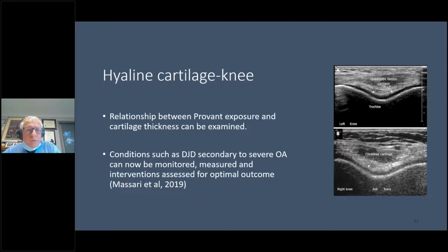I thought I'd include some of the more recent research that has been sparked by the use of pulse electromagnetic fields. So a novel outcome measure is using diagnostic ultrasound imaging to quantify the relationship between an exposure, PEMF, and an outcome, which is hyaline cartilage regeneration. I think this is probably going to be something we will be embarking on here at this facility. We have been doing diagnostic ultrasonography since 1997, so it's in our wheelhouse, and it's something that we're interested in doing. In the meantime, other groups around the globe have been doing it for the last 4 or 5 years. I have a whole list of references in the back for those who are interested in exploring that a little bit more.